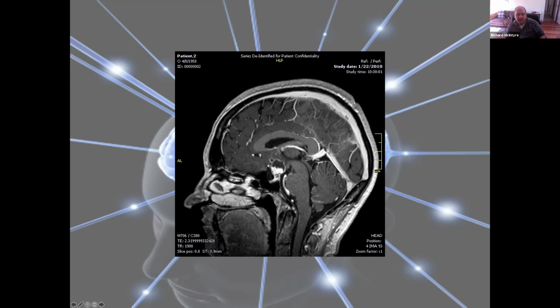Contrast doesn't affect T2 as much. And we see the sinuses are always bright after contrast. We'll get to that next year and the year after. But excellent. T1, so that's a T1 weighted scan, MRI sagittal.